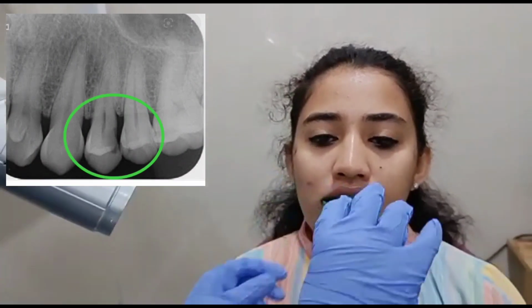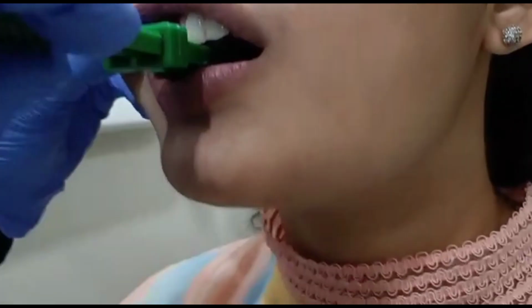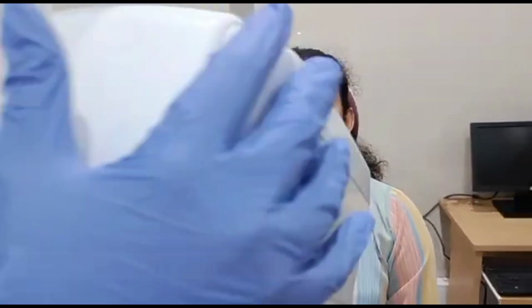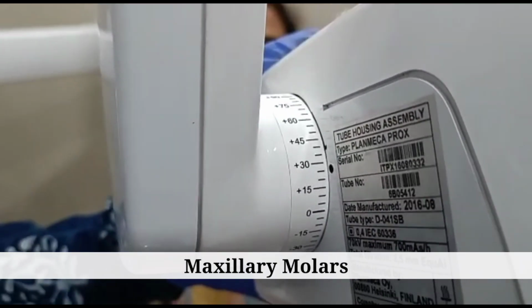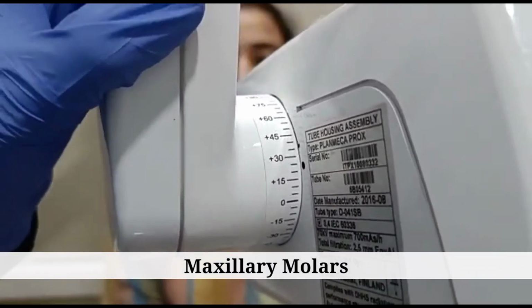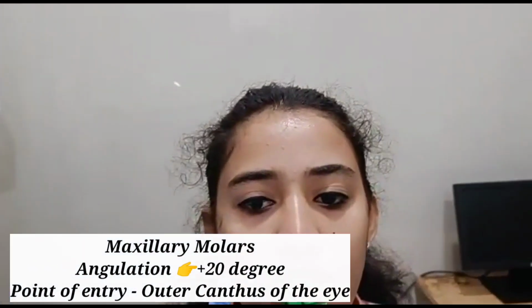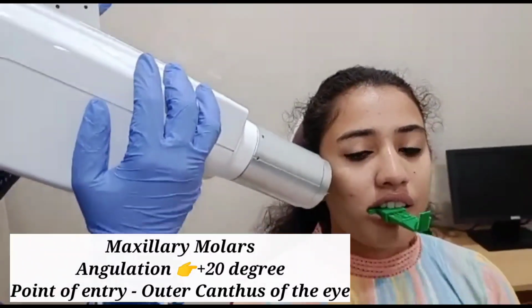Now next we are trying to position for the maxillary molars, such that the receptor is rotated into position with a firm and definite motion, and we place the film as far posterior as possible to cover the first, second and third molar areas. Next we are giving a vertical angulation of plus 20, and the central ray is directed in such a way that it passes at right angles to the buccal surface of the molar teeth.